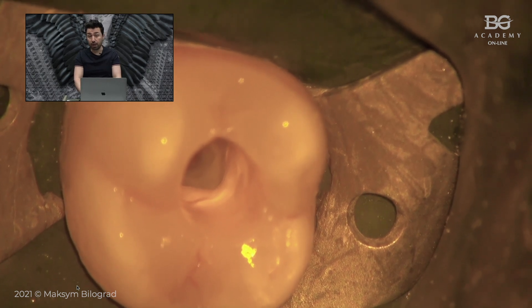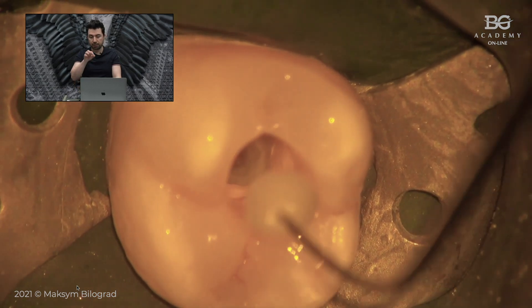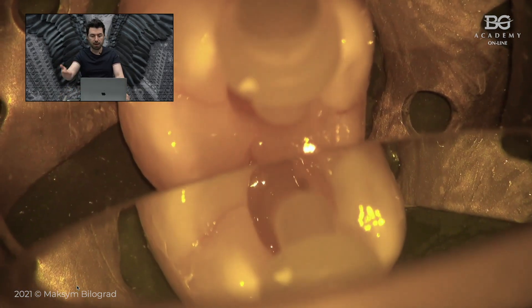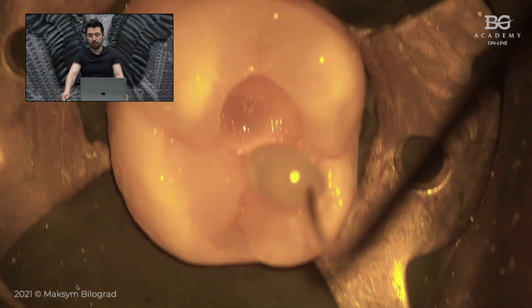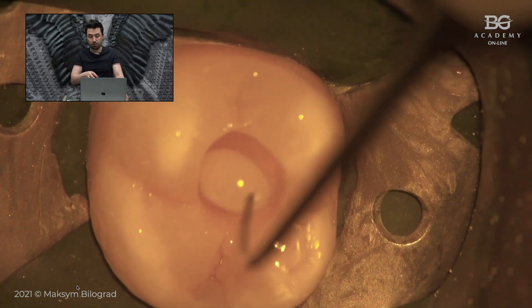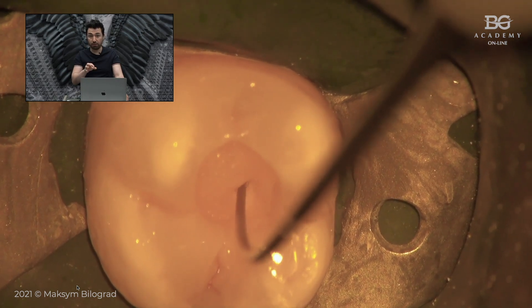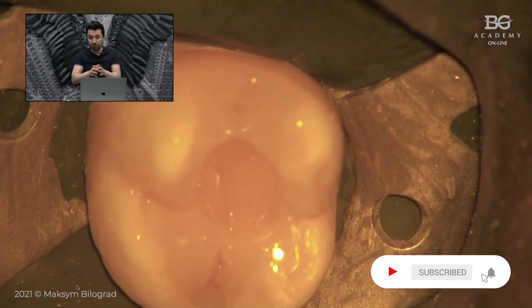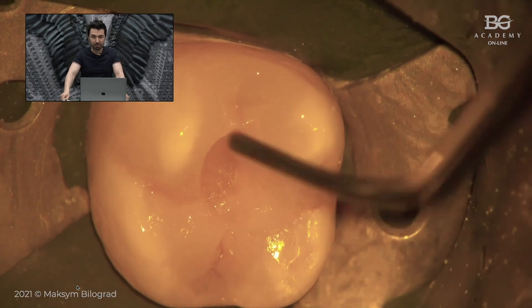On this video you can see exactly what I was describing. This is the portion of composite that we pre-cure — I try it in, it has to fit. Then we light-cure it and start our normal protocol: etching, rinsing, bonding. Then we go with a dual-cure composite — it is liquid — we fill the pulp chamber, and straight after, very quickly, we take our pre-cured portion of light-curable composite, push it down, and it forces the core build-up material into those tiny spaces. It acts like a plug using the pre-cured portion.